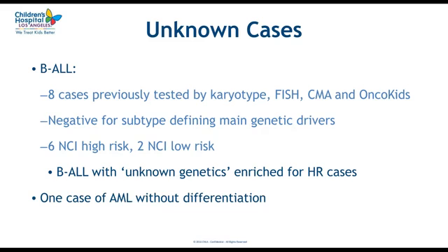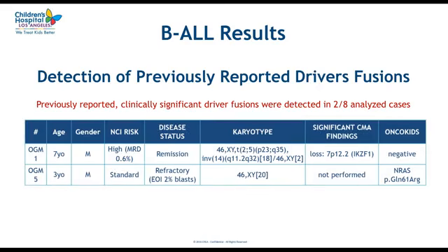And I think that stresses the importance of having better and more efficient methods to tackle these very difficult cases that remained unknown, since those are the high-risk ones where you, from diagnosis, want to know as much information as possible and choose the right approach. So I will dive immediately into our results with optical genome mapping.